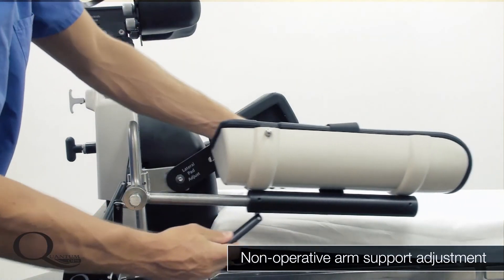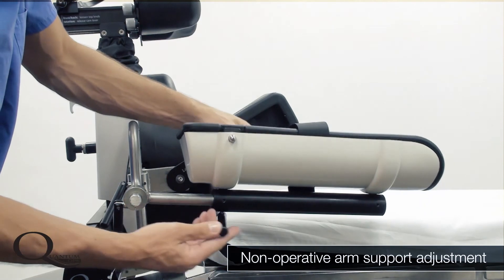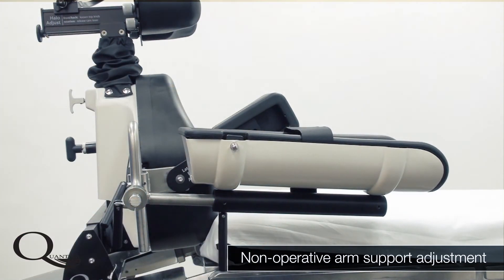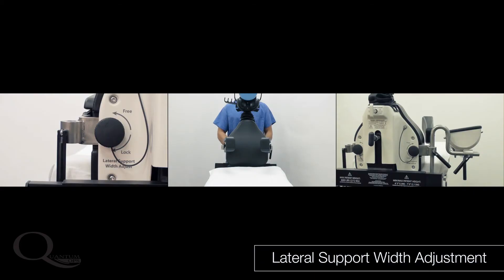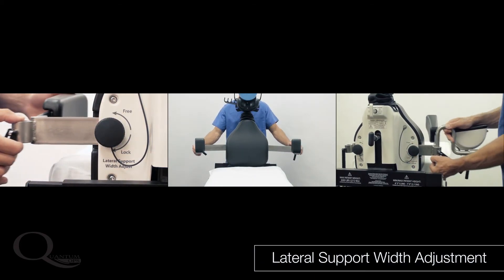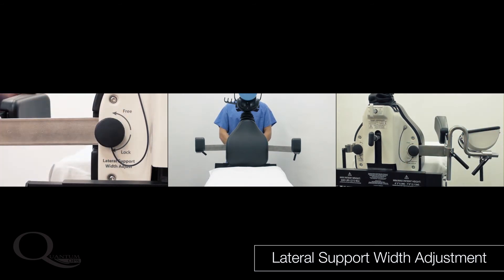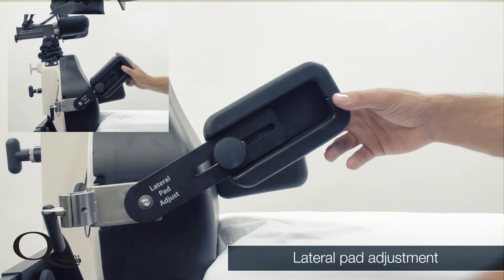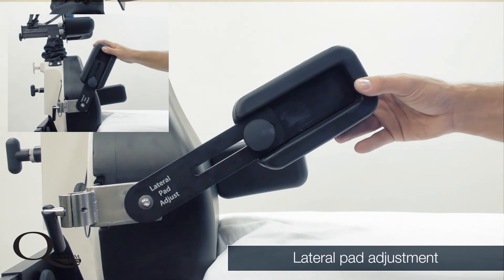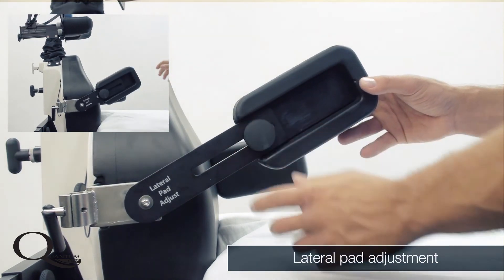It is important to check the position of the arm support after the patient has been elevated to the surgical sitting position. By loosening the knobs on the back of the device, the lateral pads are adjustable to accommodate any patient width. They open and close to adjust to patients as large as 600 pounds and adjust anterior-posterior and inferior-superior to achieve ideal placement on the patient's torso.